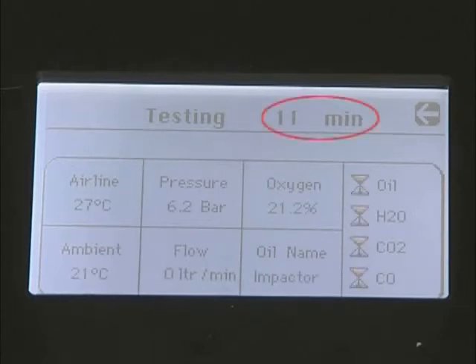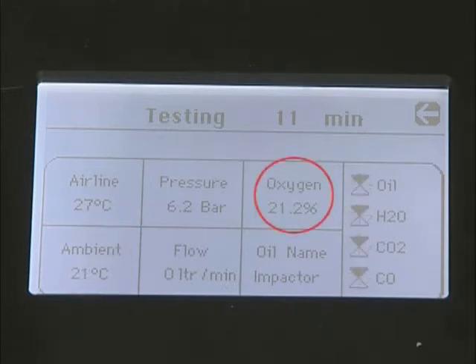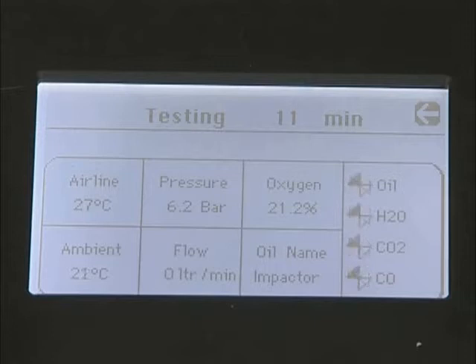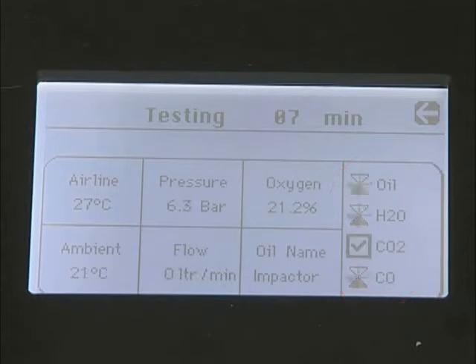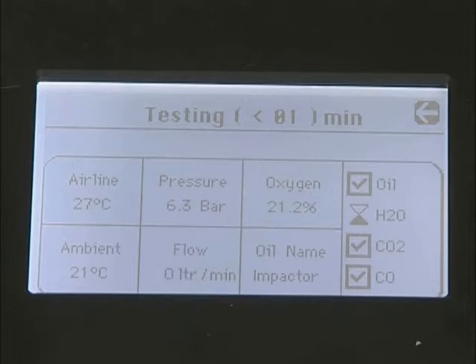The duration will be displayed as a countdown, together with airline temperature, ambient temperature, oxygen content, and pressure. The status of the individual tests is indicated on the right-hand side of the display. The spinning egg timers indicate tests are active and ticks indicate tests are complete. The unit can be left until the test time has elapsed.